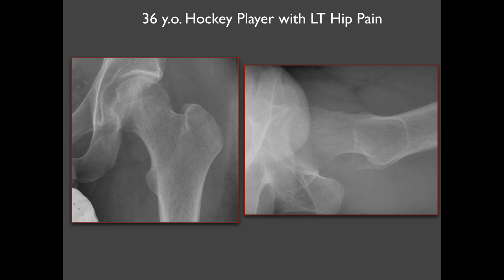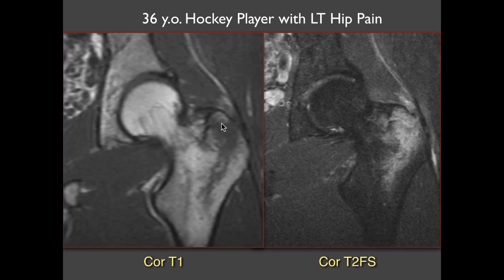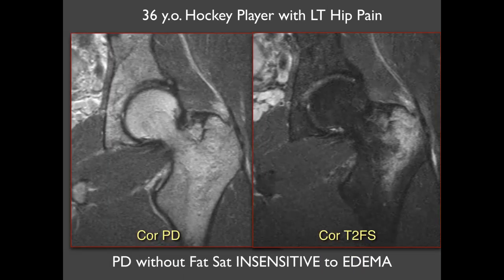Here's a younger patient with a hockey injury. The femoral head-neck junction looks good, trabeculae look good, trochanter looks pretty good — nothing definitely abnormal on the true lateral view. With continued pain and suspicion for fracture, he went to MRI. Abnormal signal was seen in the greater trochanter, with a subtle fracture line and edema on both sides. Some edema extends into the femoral intertrochanteric region but didn't traverse the shaft, so this was treated as an isolated greater trochanter fracture.